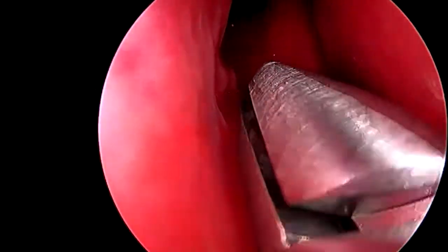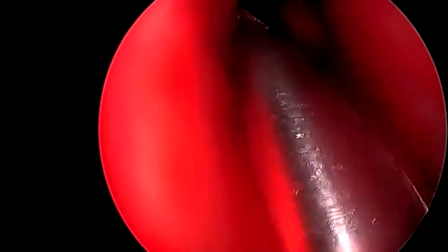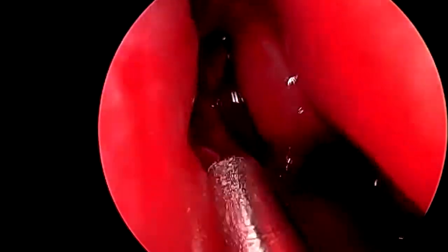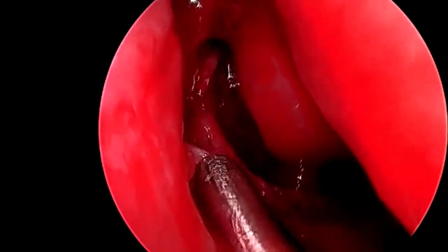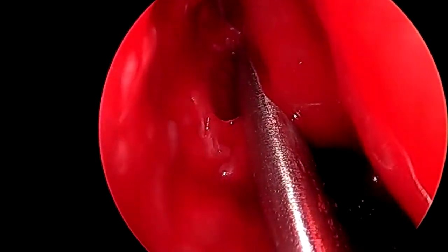Once the flap is adequately elevated, additional bone needed to be removed. This was performed with a Kerrison, and a Blakesley forceps is used to remove some scar tissue in the region. The Kerrison is again used until all of the neobone formation is adequately removed and the osteotomy is of the desired size.